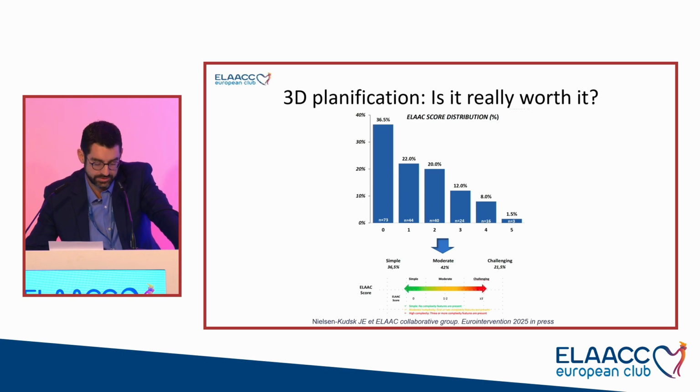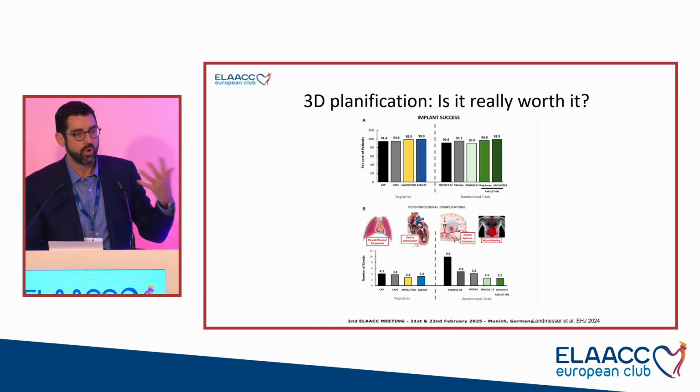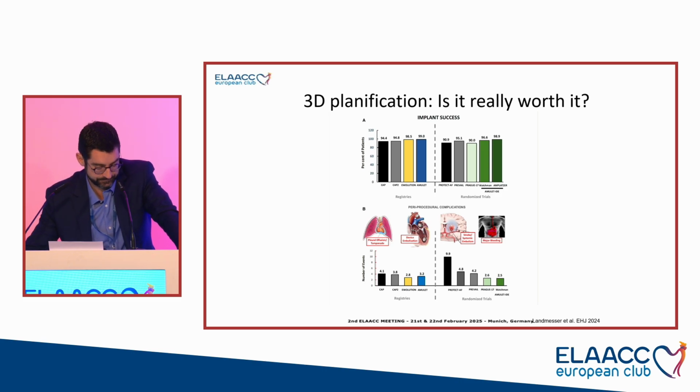There is a large majority of simple to moderate complexity of anatomy. And if you look at the overall implant success and the peri-procedural complications, we see that with the increased experience of the operators, the implant success is nearly 100%, and the peri-procedural complications are going down.